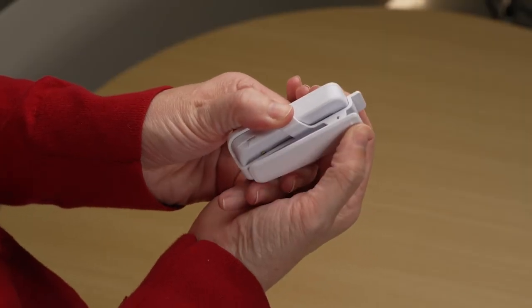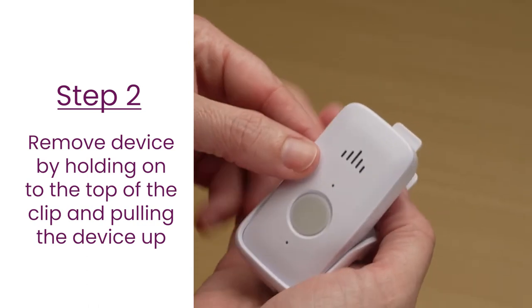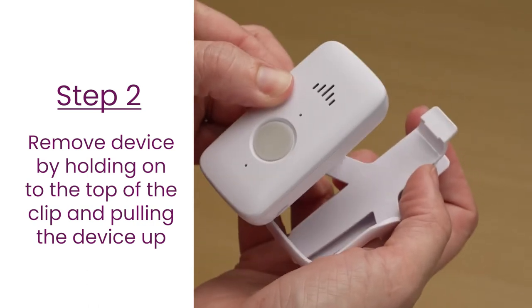To remove the device from the clip, push the lever at the top of the clip with one hand and pull the device up and out of the belt clip with the other.